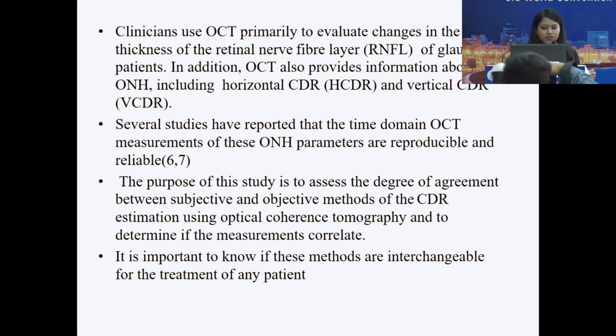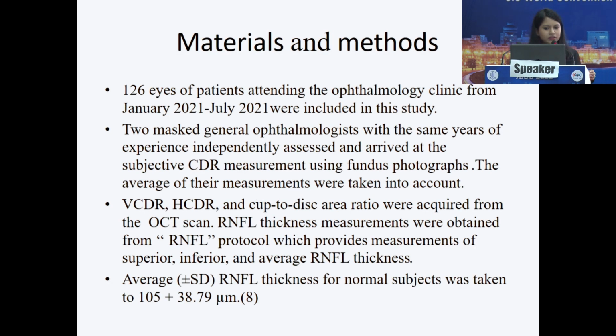The purpose of this study was to assess the degree of agreement between subjective as well as objective methods of the cup to disc ratio estimation using optical coherence tomography and to determine if these measurements correlate. It is important also for us to know if these methods are interchangeable for the treatment of any patient.